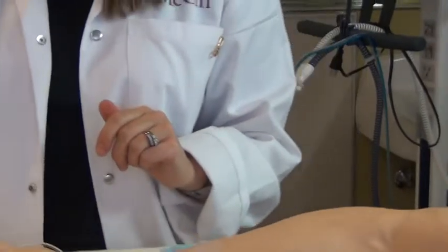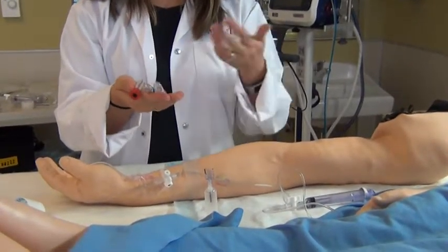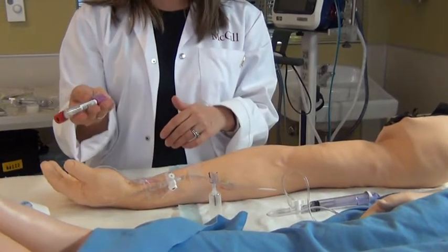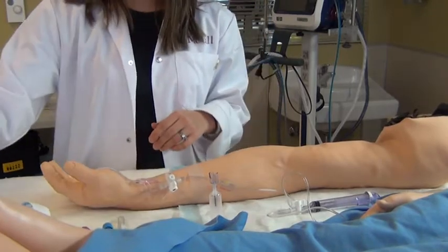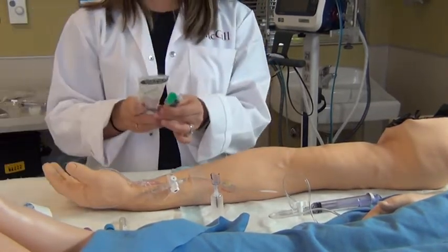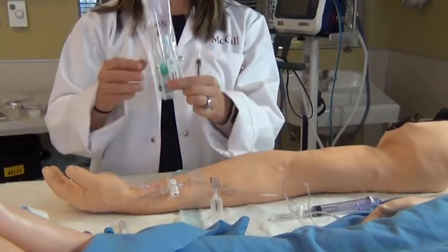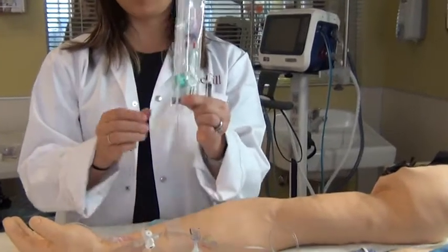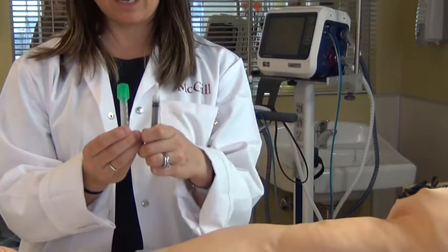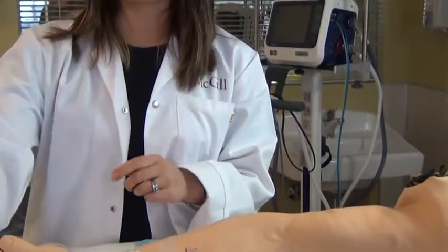Another thing that you will need is obviously your tubes. If you're sampling blood for CBC, CMP, or any other blood test, you will use the corresponding colors. If you're sampling arterial blood, you may have to use different syringes. You may see a syringe like this or a syringe like this. Okay, if it's open, a syringe like this will actually look like this, and it has a little green cap. Depending on the setting that you go into, you might see different syringes.